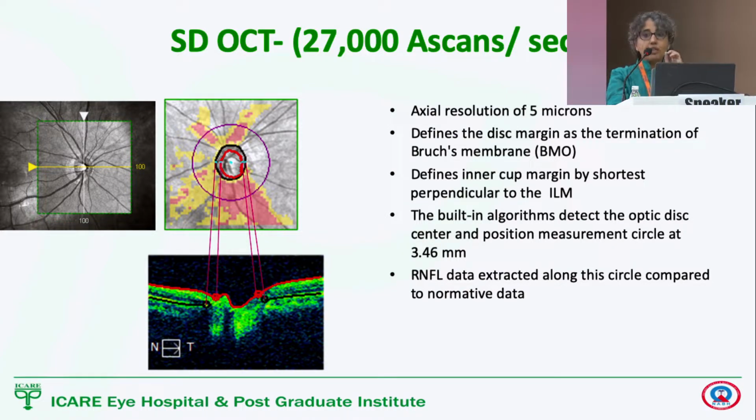And it's important that when you look at a printout and you've seen the eye, you check that the detection that the system is doing is done correctly, because all the calculations are going to be based on its structural detection of where the optic nerve head lies. And that is an important training you also give your operator.